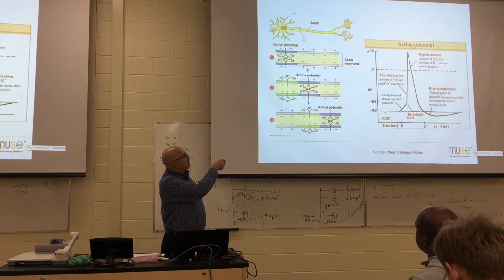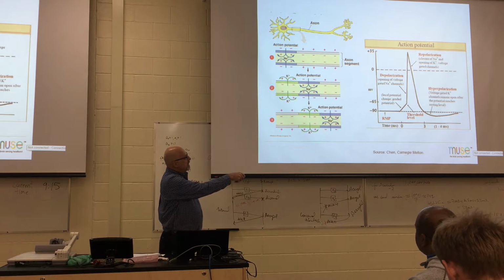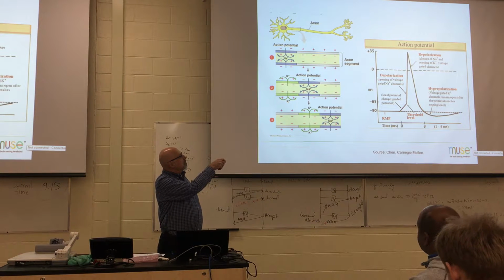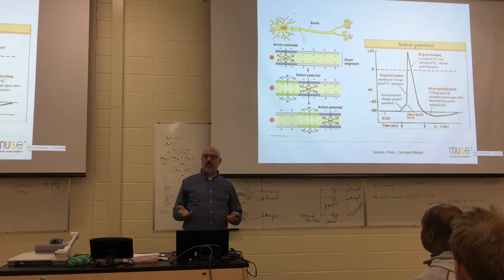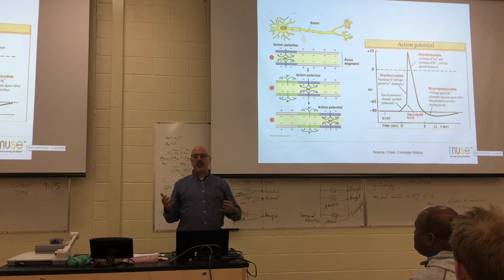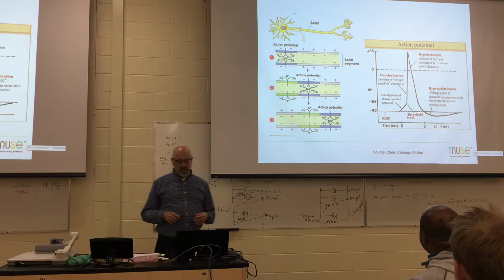As the wave propagates down, sodium ions go inside and potassium ions go outside, and it's this movement of ions that creates this shape of voltage. If you were to have a probe right outside this axon, this is what you would see. What we're measuring at the scalp is the summation of tens of thousands of these neurons firing in unison, in waves, and in a pattern. So the summation of large amounts of neurons is what we're measuring at the scalp.